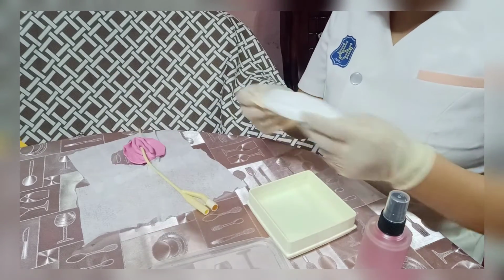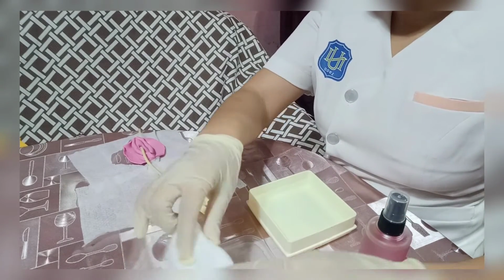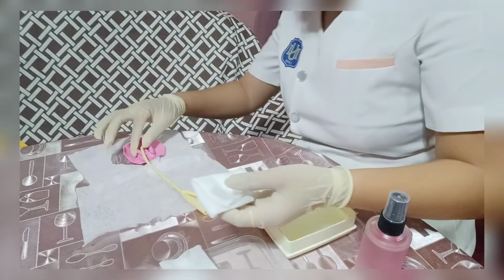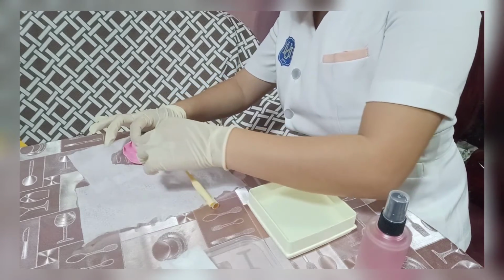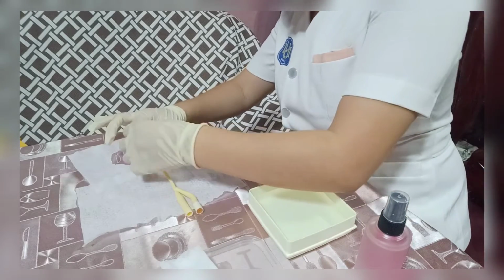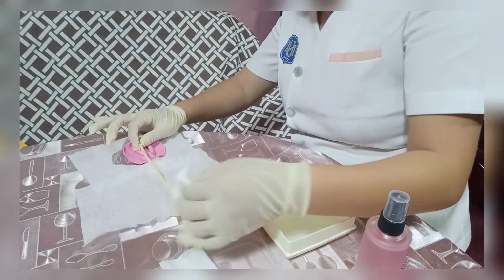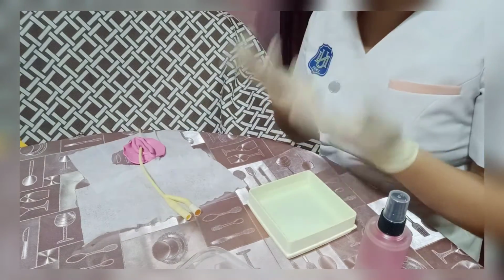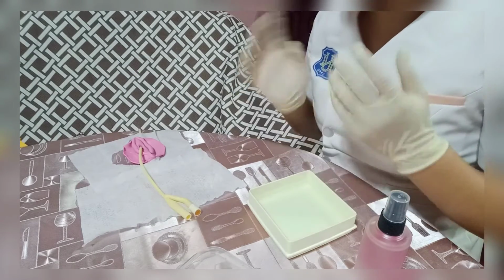Repeat it 3 times. After cleaning the catheter, we have to perform perineal care.